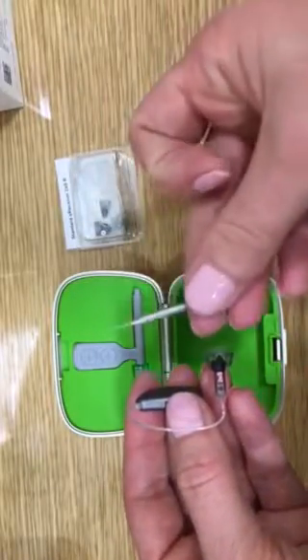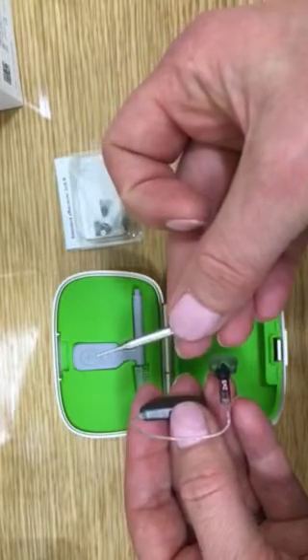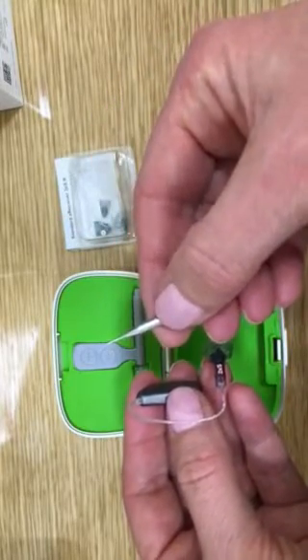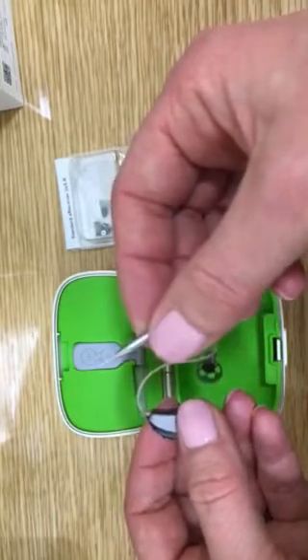What you will need is one of these — it's a pin removal tool. If you don't have one of these, then a safety pin should do.